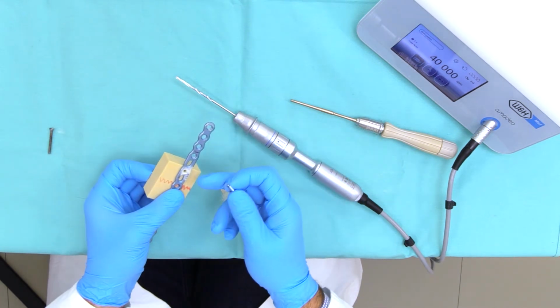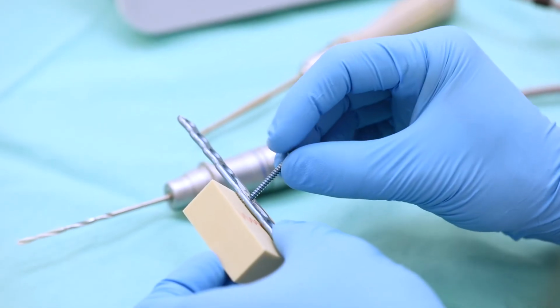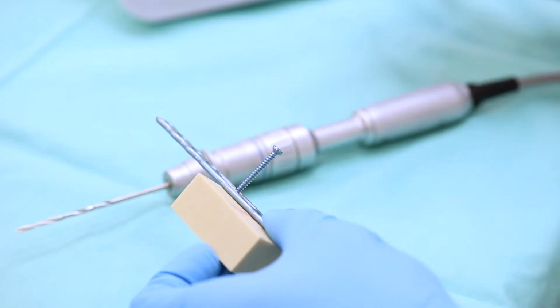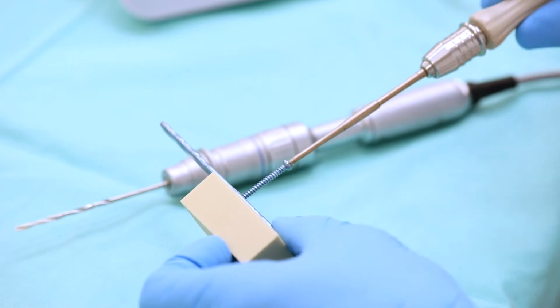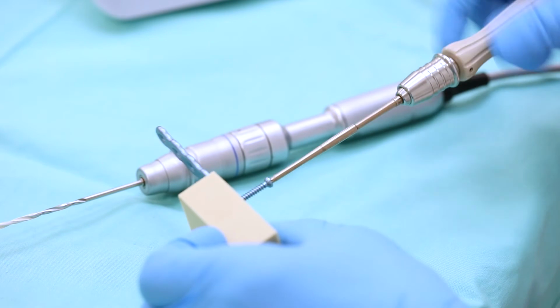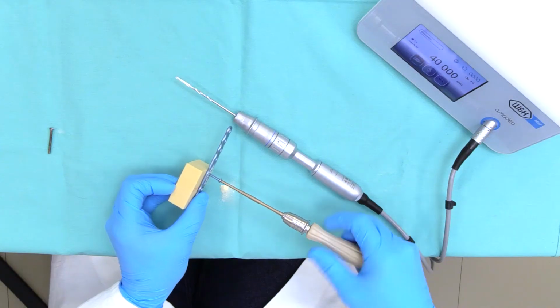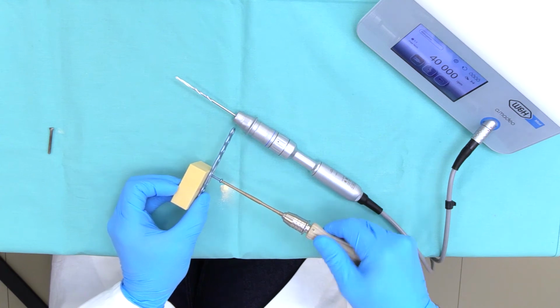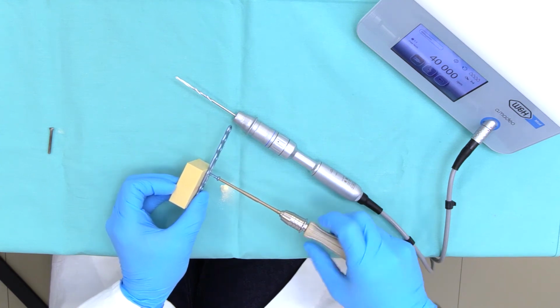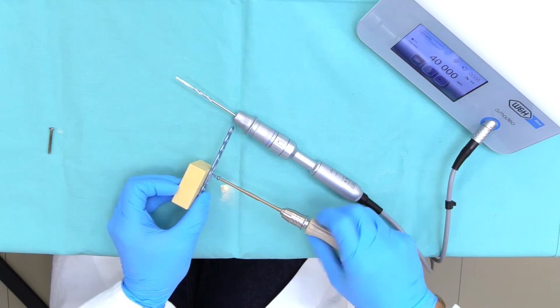We first use a conventional screw. You can do this by hand or using a machine. If you use a machine, be aware not to over-tighten the screw.